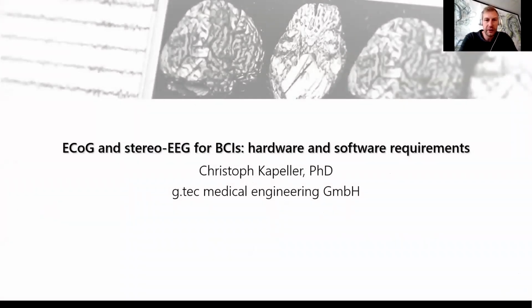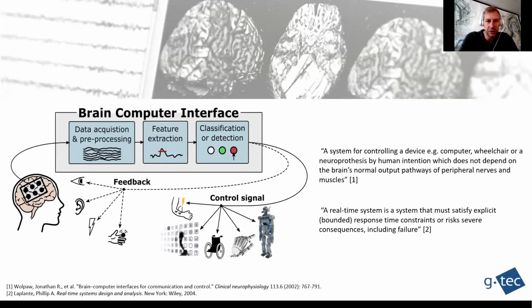So this session is now about the hardware and software requirements that we need to consider when we want to establish an ECoG Stereo-EEG-based brain-computer interface. And let's check already what the general requirements are.